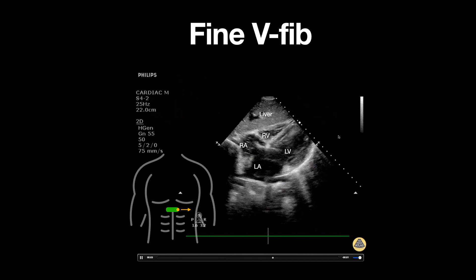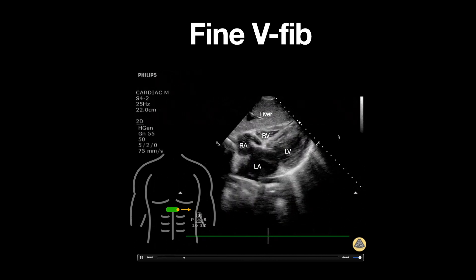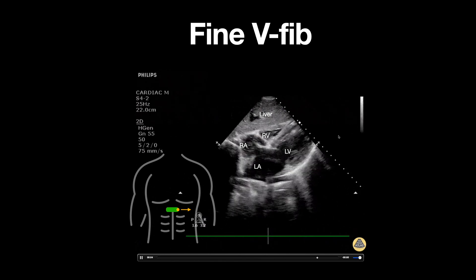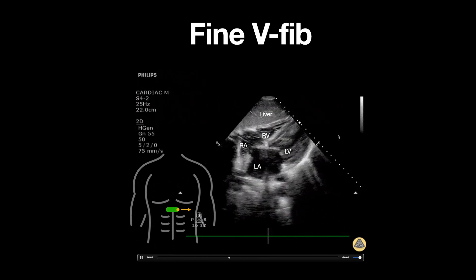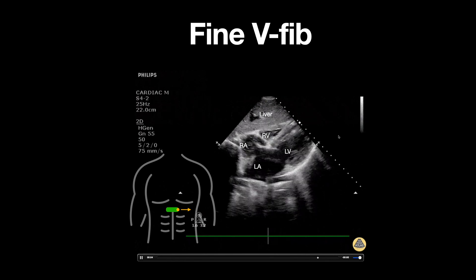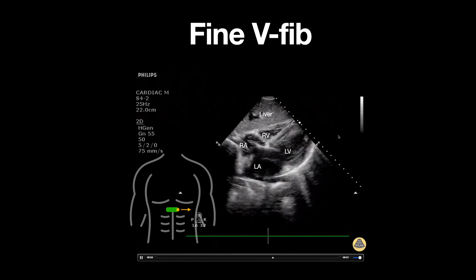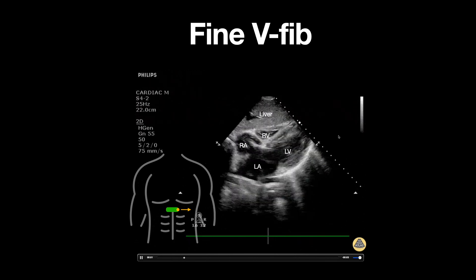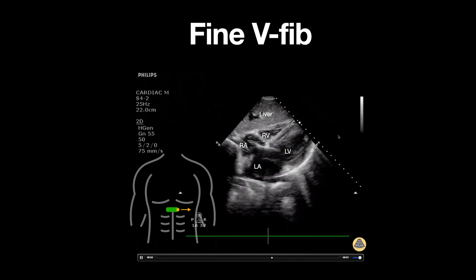In general, point-of-care ultrasound should not be used to diagnose ventricular fibrillation, as this should be seen on the rhythm monitor. However, as in this example, it's not always clear-cut — especially if the fibrillation is fine with low voltage that could be construed as either PEA or asystole.